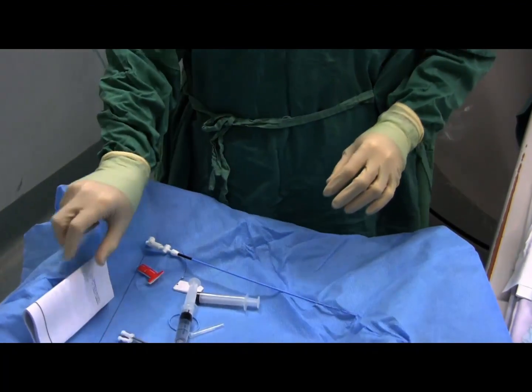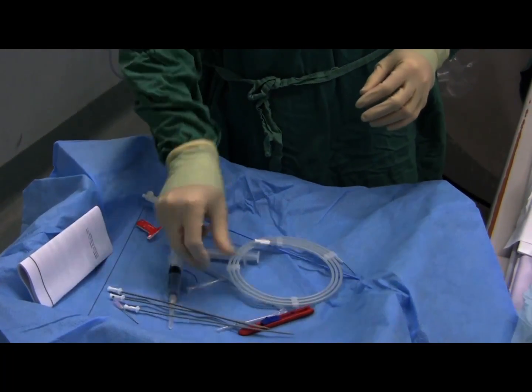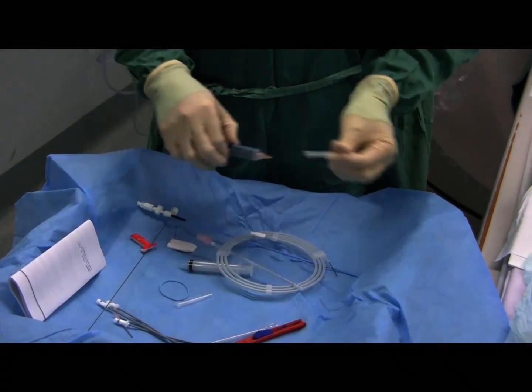This is going to be Seldinger technique, so we're going to put the needle in first, followed by the guide wire, followed by some dilators, and then place the actual drain itself. So job number 1, however, is local anaesthetic.